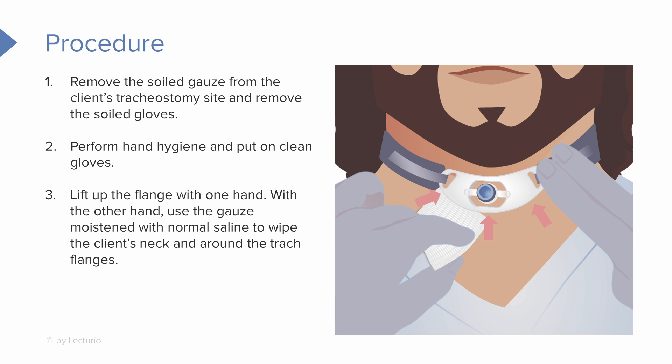Then we're going to use that moistened gauze that we had already prepped and wipe around the patient's neck and under the trach flanges.